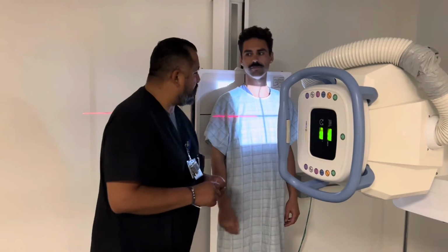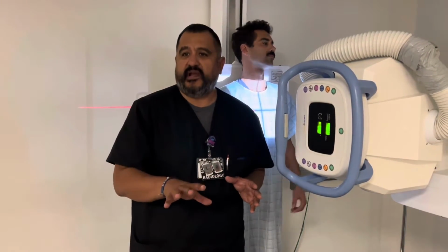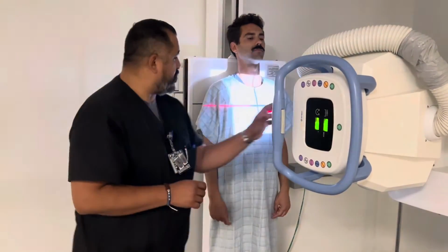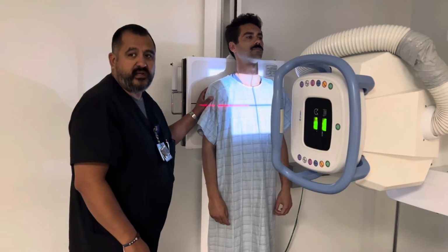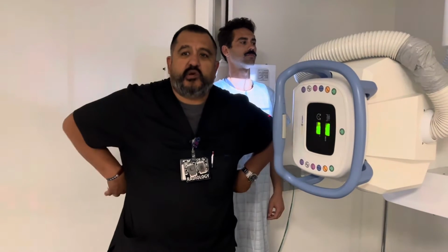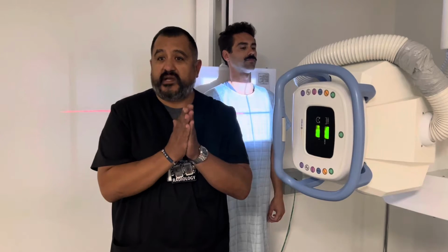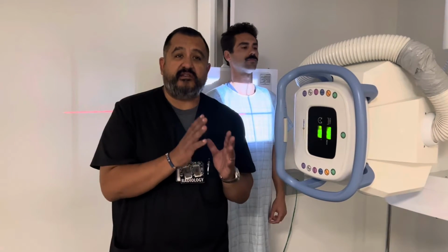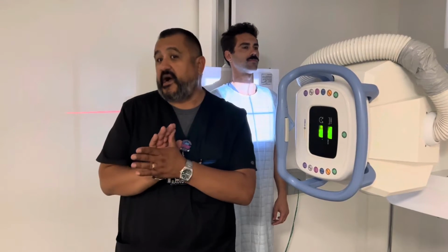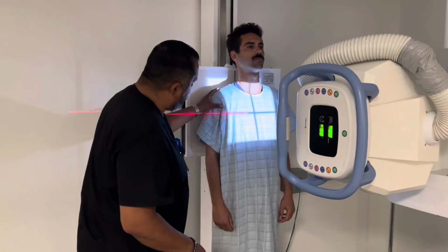We're going to start here. We'll do the right ribs, and then we'll do the left ribs. I'll do them separately for you guys. If the patient had a posterior rib injury, you're putting the back against the board, so your projection is going to be AP. Remember, you want to keep the site of interest closest to the IR when it comes to ribs. So if the site of injury is on the posterior side, you try to get the posterior side closer to the IR.